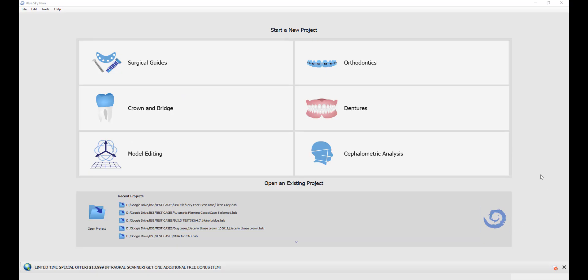This is Michael Saltzman from Blue Sky Bio. I'm going to demonstrate the process of creating a crown on a titanium-based digital abutment.